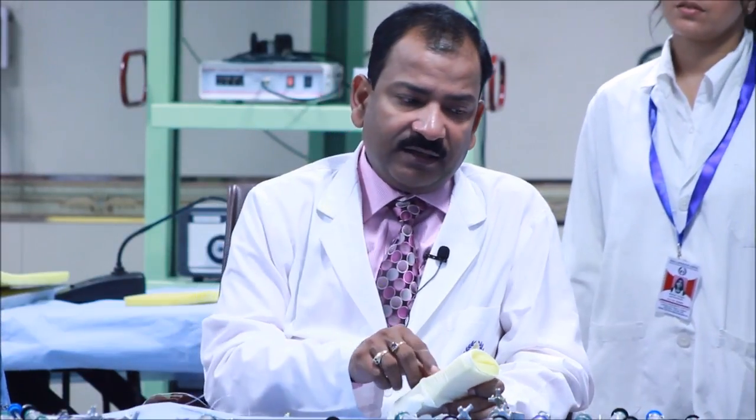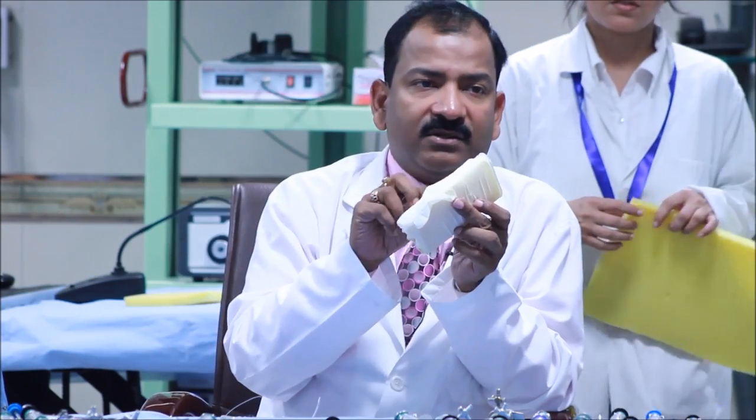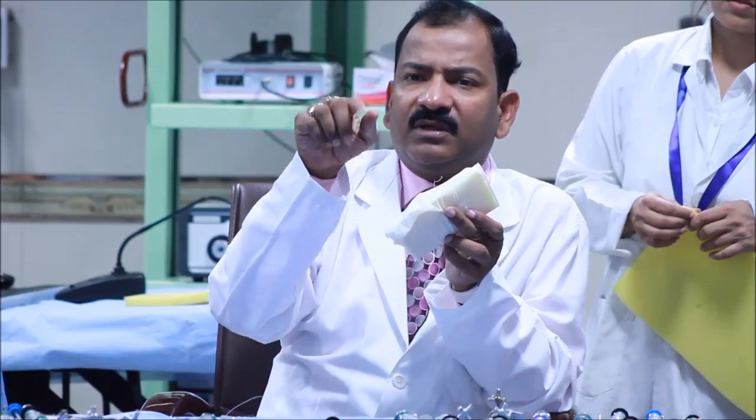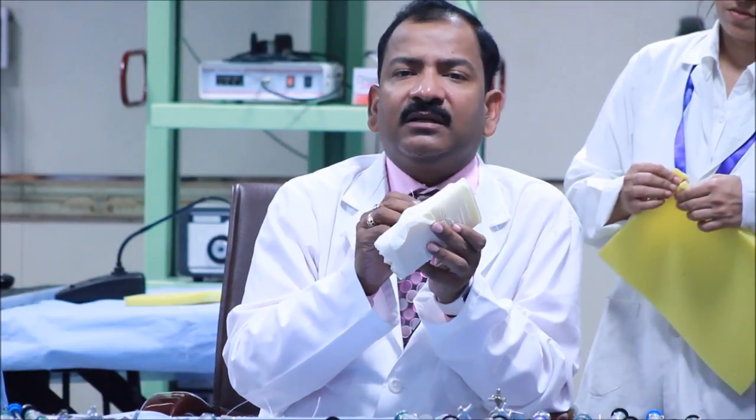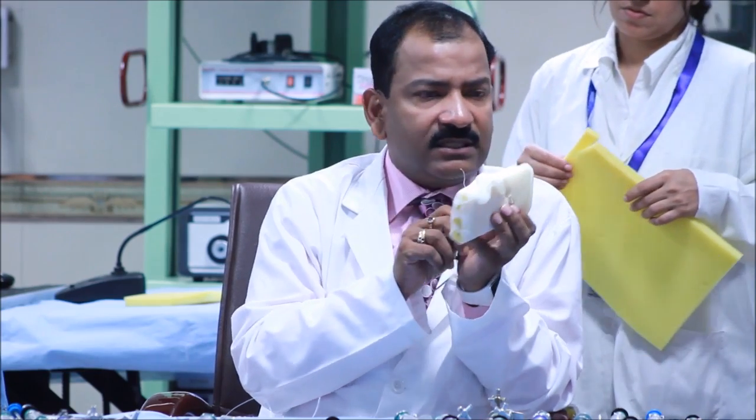There is another way. This is also used for two-port cholecystectomy, two-port appendicectomy, or ventral hernia surgery to fix the transfascial fixation of the mesh in the ventral hernia. We use it for transfascial fixation. So, I will demonstrate this to you later also. If you put in YouTube Veress needle port closure, then you will see my videos there also. But right now, I will just demonstrate how to do it. Again, I will show you once more.